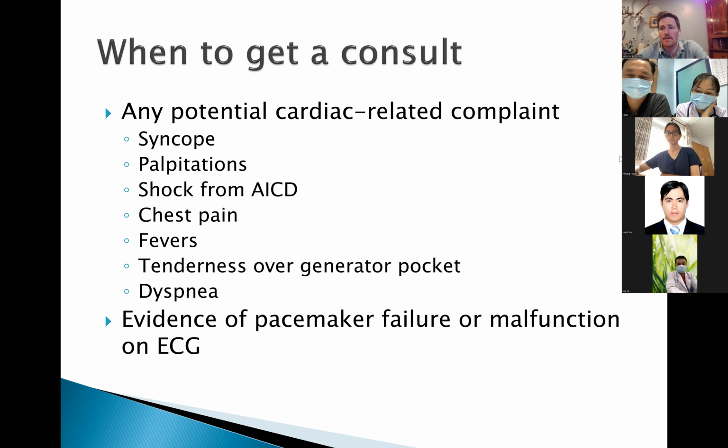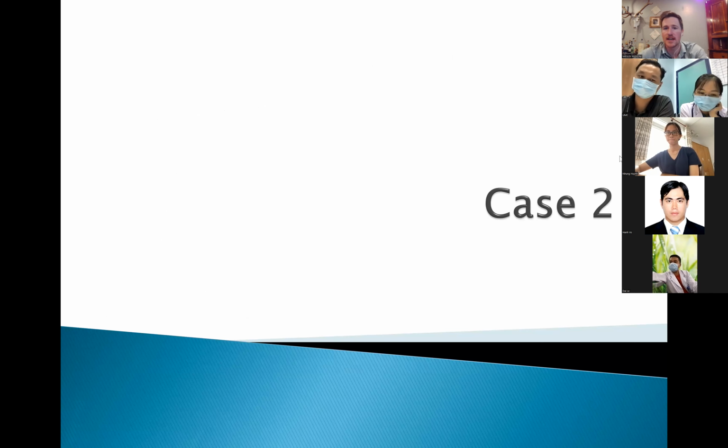So if they had a recent pacemaker placed and a fever, that's probably when I would get a cardiology consult. If they have tenderness over the pocket where they have the pacer placed, if there's redness, or it looks like there are signs or symptoms of infection, definitely get a consult. And then if there's any evidence of pacemaker failure or malfunction on the EKG.